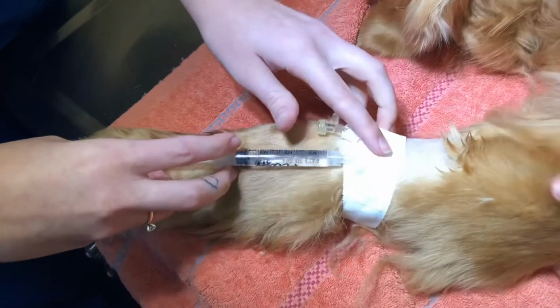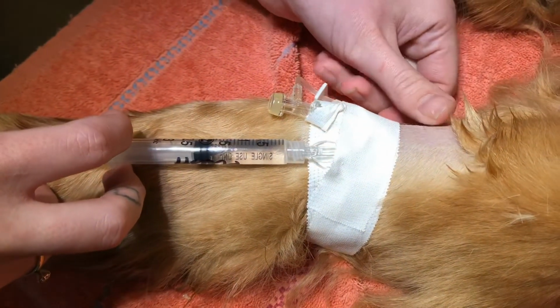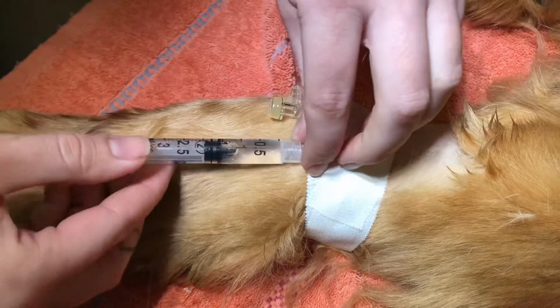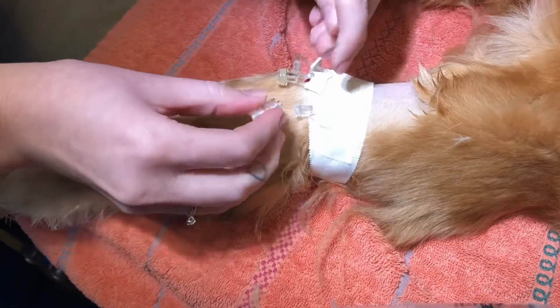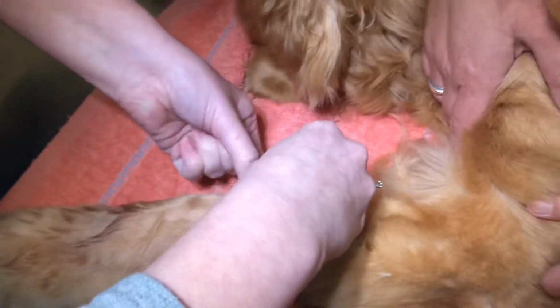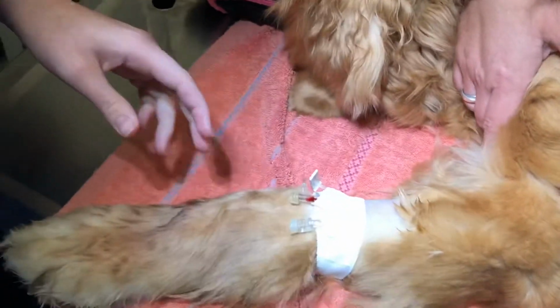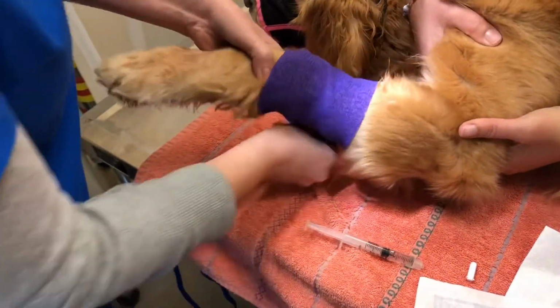Okay, and then I'll make sure my catheter is patent by pushing some flush through, and it's flowing easily. So I'm going to now take my male adapter plug and attach that. Also going to close off my T-set. So the catheter is ready for use, but since we're not going to use it right away, I have a piece of vet wrap that I can use to keep it clean until it's ready for use.